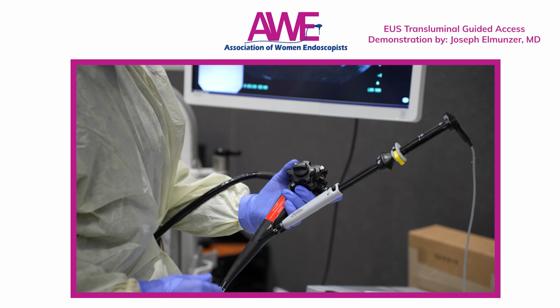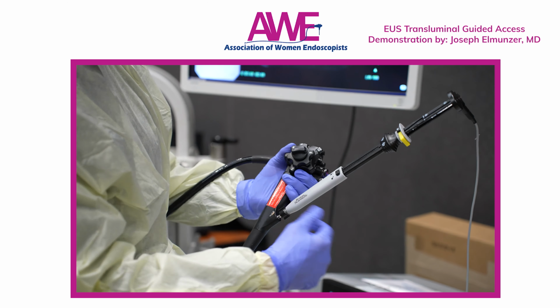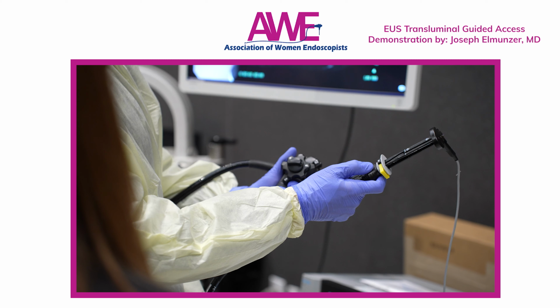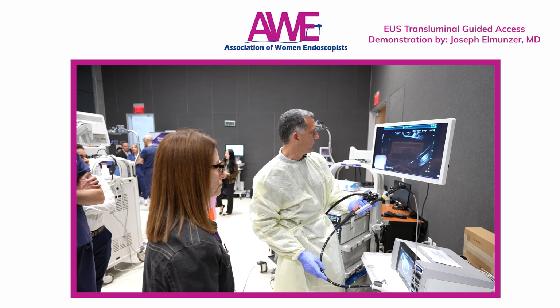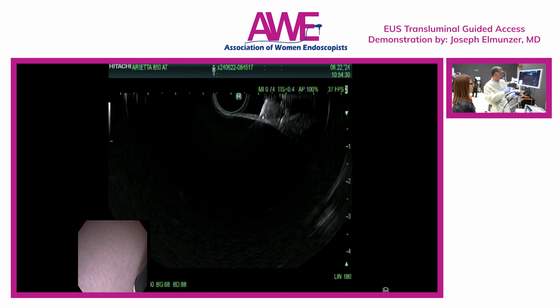The first step, for those of you who aren't terribly familiar, is you would unlock what's called the catheter hub, and then you would advance the nose cone, which is the deployment catheter that contains the stent, to the wall. If you're seeing the screen as well, I'm going up and down with the elevator just to demonstrate a little bit of movement with the tip of the device. And again, that device has the prosthesis within it.